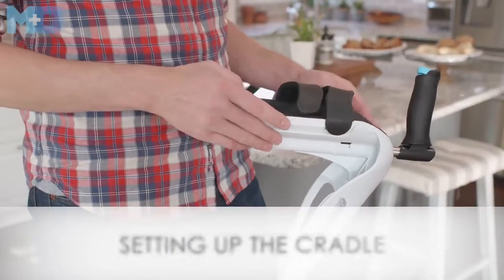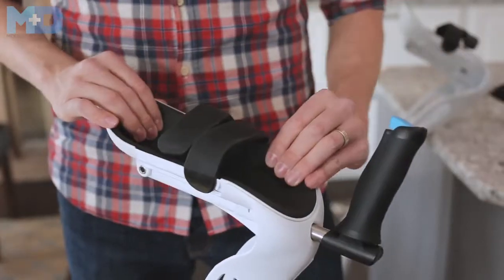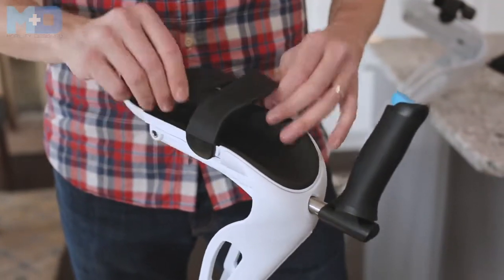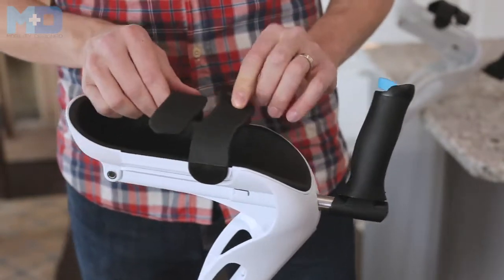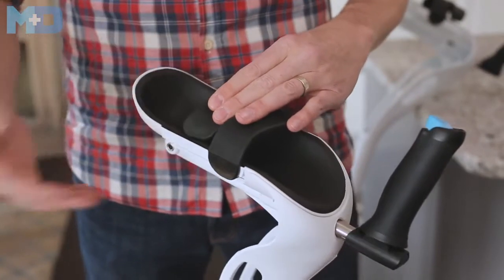So here we have what's called the cradle. The cradle is what holds your arm. There's the arm pad here that is an antimicrobial arm pad that should never smell. On top of the cradle are 2 armbands. These armbands will show you how to adjust in a little bit, but they allow you to get in and out of your crutch and holds the crutch to your body while you use it.